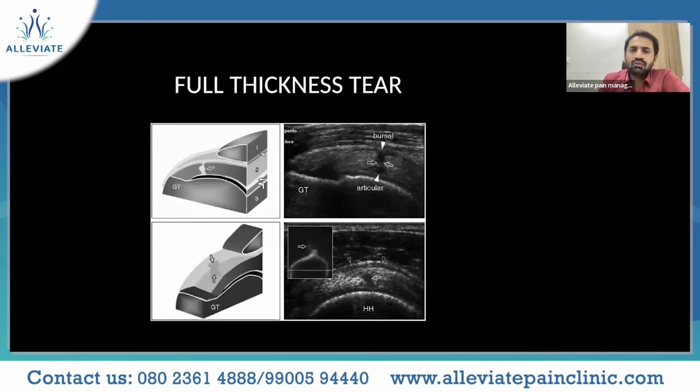Full thickness tear, sort of funnel-like it is. You can see here where your bursal and your articular surfaces both are connected, and the whole intrasubstance area is also hypoechoic.